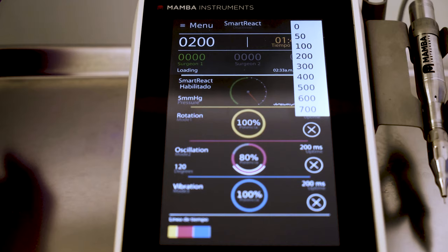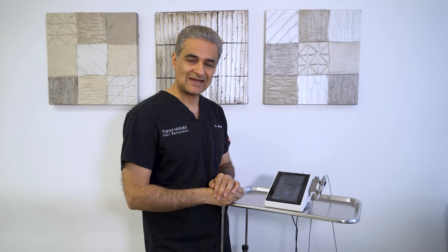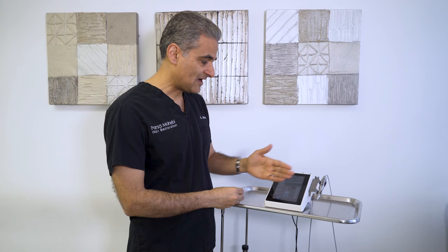You can also plan it with different timing. For example, you can set zero milliseconds after touching the skin, or if you want time to adjust your tip, center it, and know where you're going, you can set it to 100 milliseconds. That tells the smart react to wait 100 milliseconds after touching the skin before the rotation starts. That can all be configured.